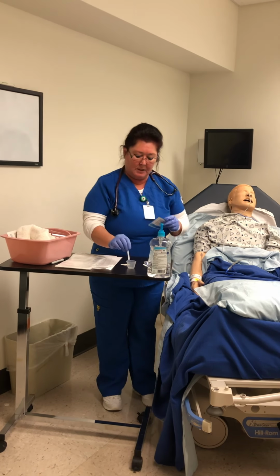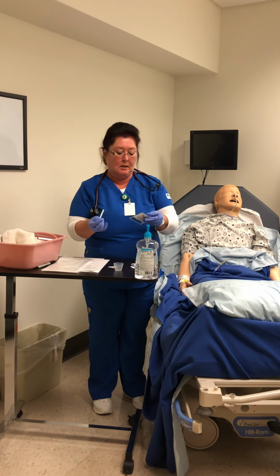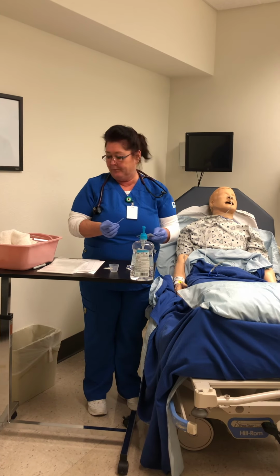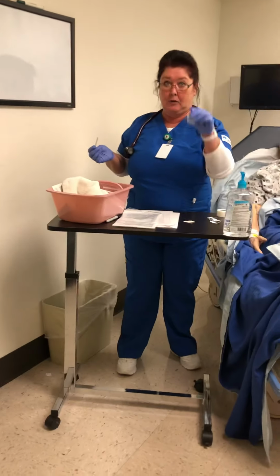And we are going to dip this in. And it's going to change color, telling me the acidity. And it looks like we're at a 3, which is good. So this would go in biohazard, as well as this.